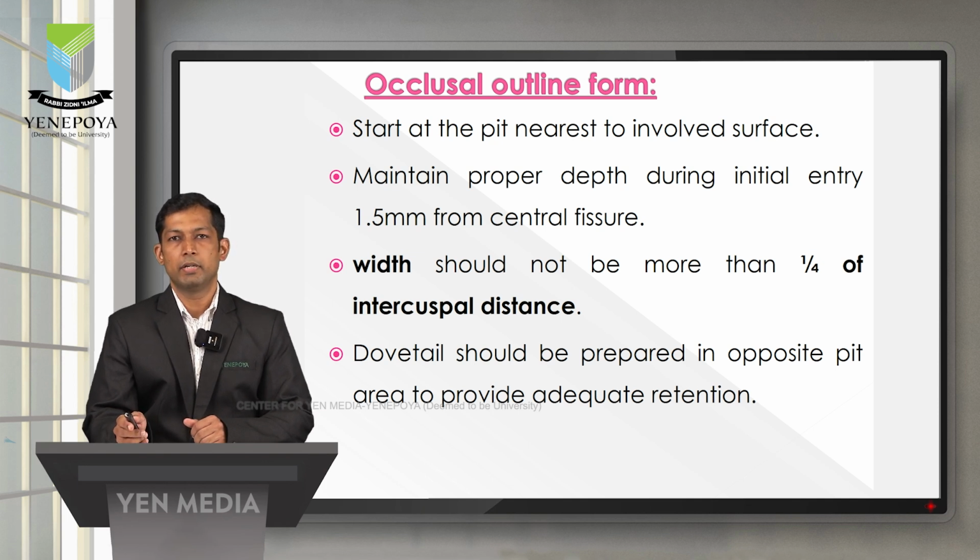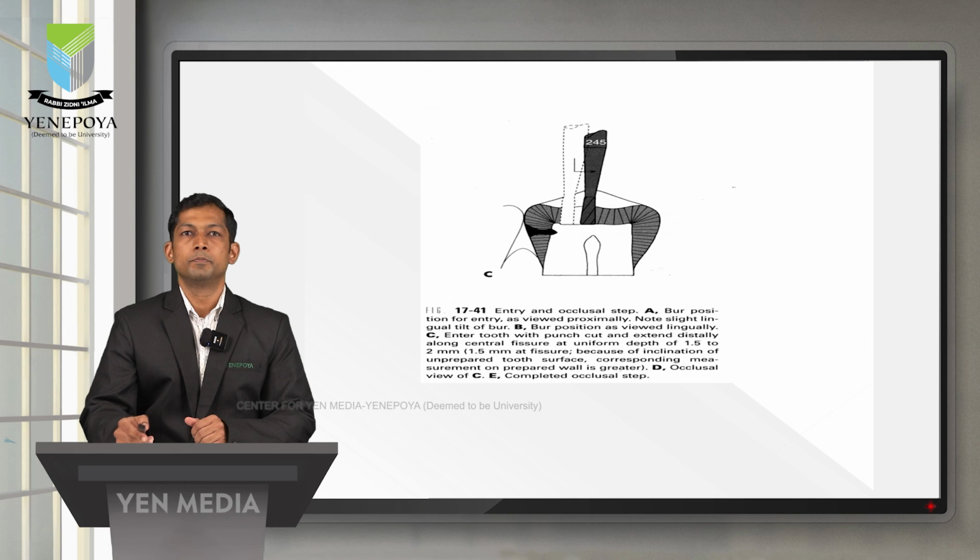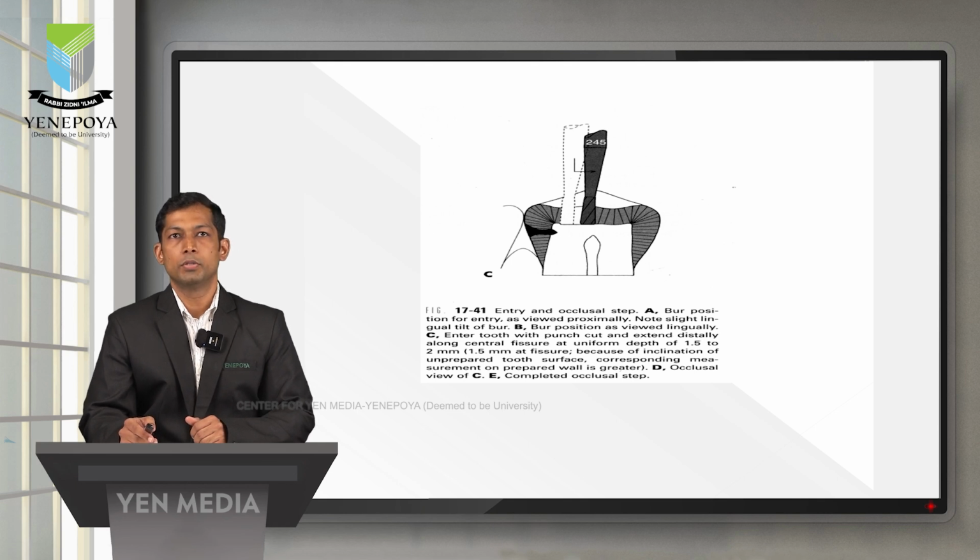That is, for a mesial cavity, prepare a dovetail in the distal aspect. For a distal cavity, prepare the dovetail in the mesial aspect. Now this picture here shows how you start with the cavity preparation.